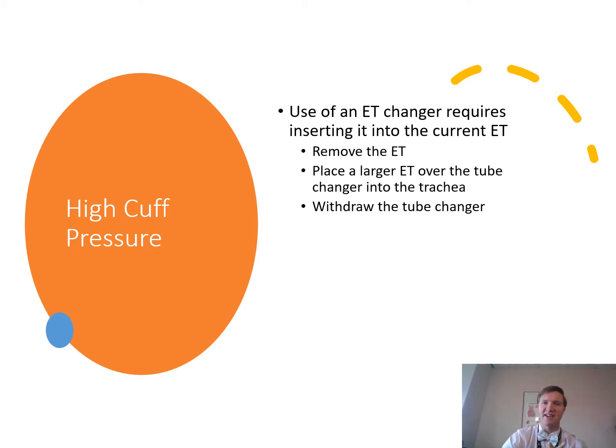On rare occasions, high cuff pressures may be required to maintain a minimal leak or minimal occlusion because the patient's trachea is dilated at the level of the cuff. Right, you might see this on your long-term patients. Occasionally, the cuff can be repositioned, but a dilated trachea suggests that the cuff has been in place and overinflated for quite some time, resulting in tracheal injury. So there are some long-term fixes to that. Sometimes, especially in your tracheostomy patients, which is where you'll see this the most, you might have to get specialty trachs that are extra long, so that they'll go deeper than where they did before. It's unfortunate, but it can happen.